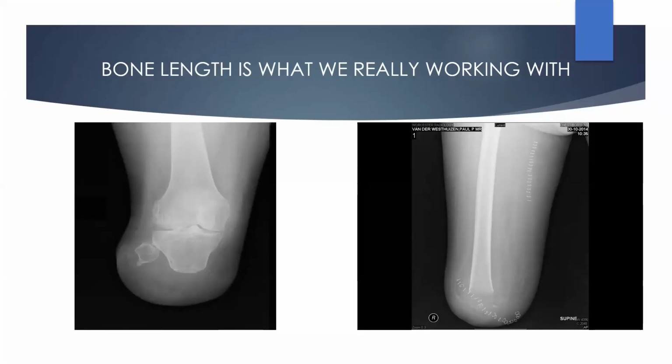Then the image on the right is a long transfemoral amputation. This particular surgeon amputated just above the condyles, which left a very sharp bone and very little space necessary for prosthetic components. Essentially they've been treated as a through-knee amputee without the ability to bear weight at the end of it. So now we've got a problem fitting the components in. So the length of the residual bone is important. Increasing the length of the residuum by leaving excessive soft tissue isn't.